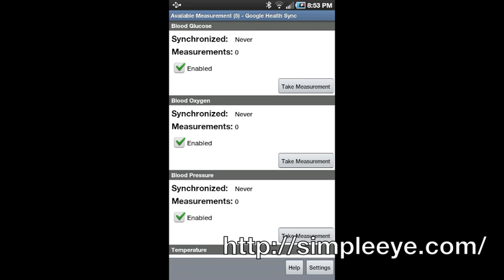Simple Eye Google Health Sync will launch the measurement application for the selected measurement. In this case, it will launch Simple Eye Bluetooth pulse oximeter.